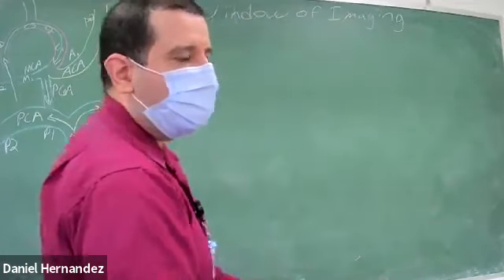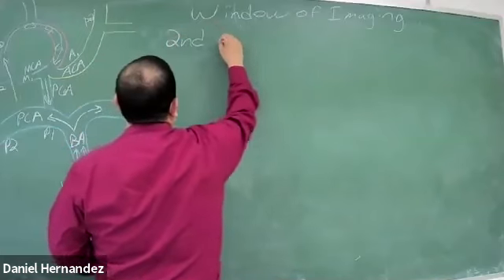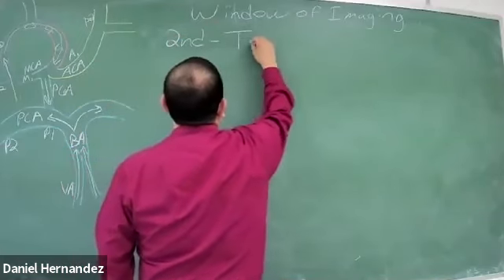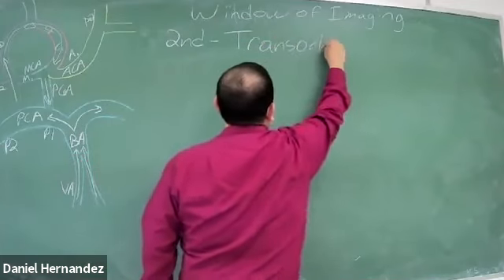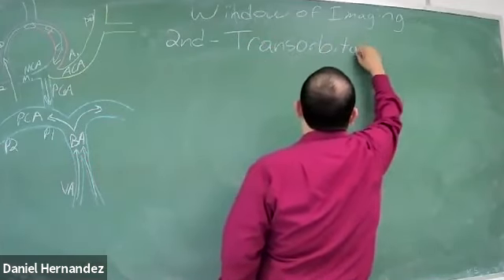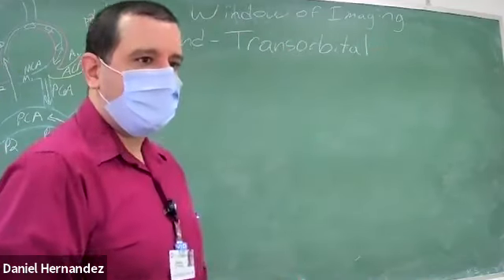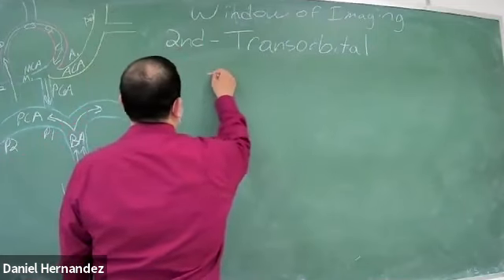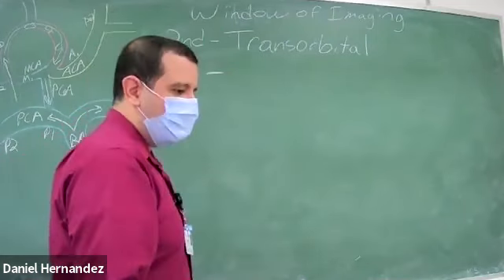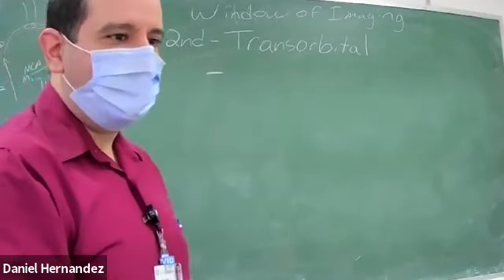So the next window, the second, is going to be transorbital. As the name implies, we're actually scanning through the eye.